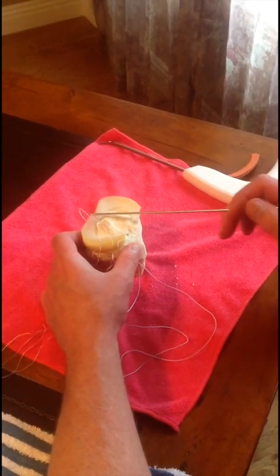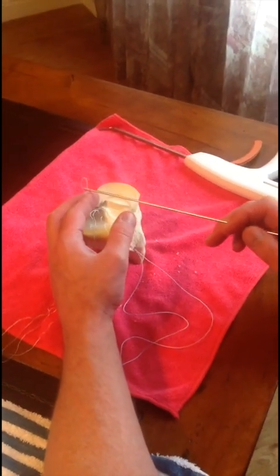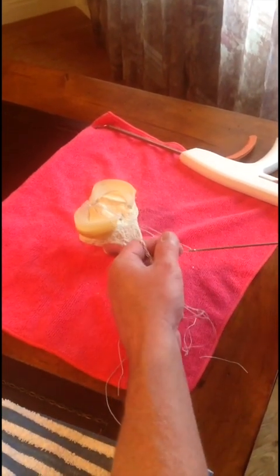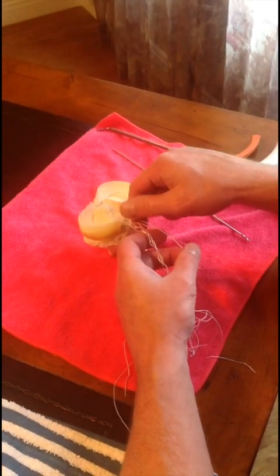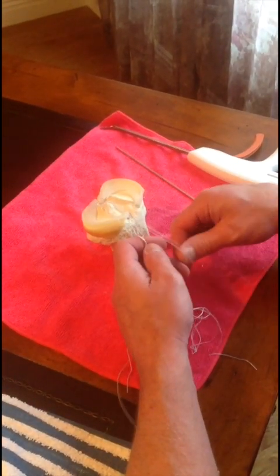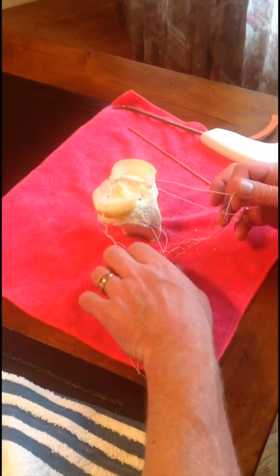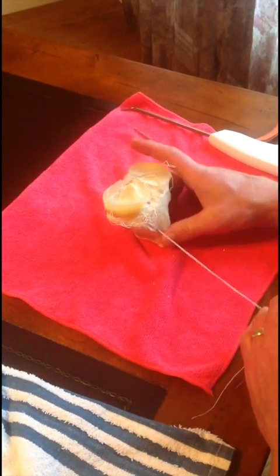Here I'm using a Parkas open eyelet pin, which allows me to push my retrieving suture up and in, and then simply just twist the pin — it offloads the loop and allows you to grasp it with your grasper. Now once you've got your loop back out your portal, you have to take an important step: grab all of your suture limbs using a simple suture shuttle technique to make sure that you pull them all out through the same portal and there's no tissue bridge. Once you have assured yourself of that, it's a simple matter of loading the sutures into the pulling loop and then pulling them down into your tibial tunnel.